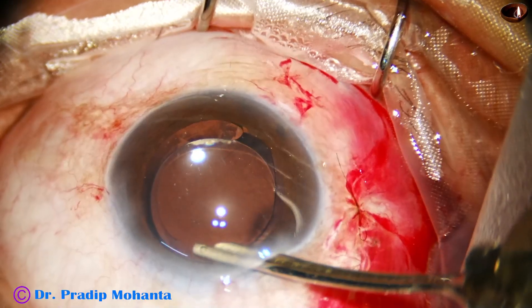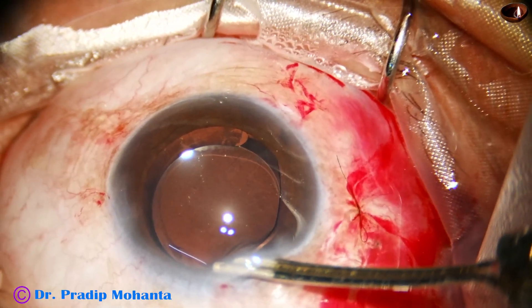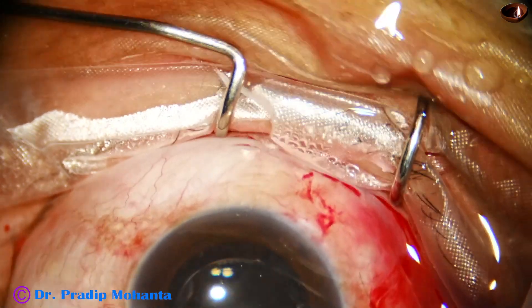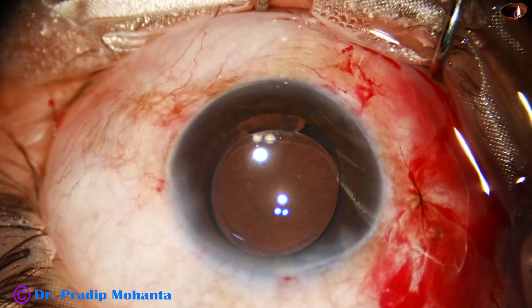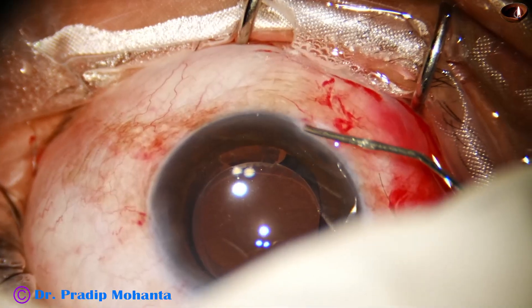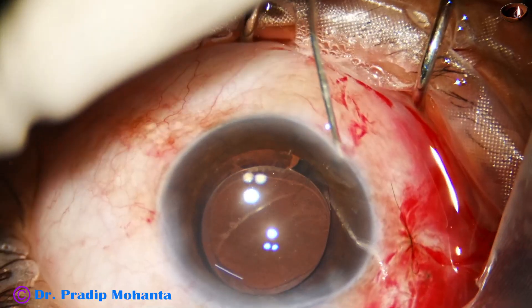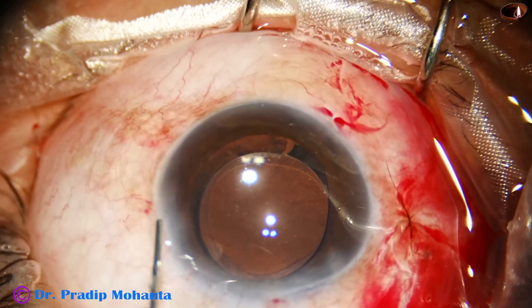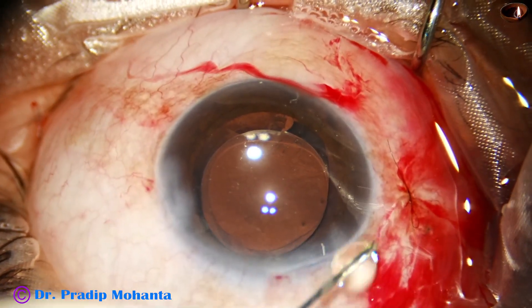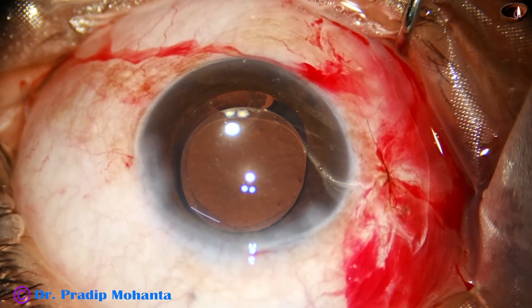If you failed to place the trocar, all of us anterior segment surgeons are afraid of a trocar — but should not be. In this case, the trocar could have gone in if it were sharp, but because I reused it, it didn't go. Now I am using moxifloxacin to close the side ports; some amount of moxifloxacin will go into the anterior chamber and this will prevent infection.